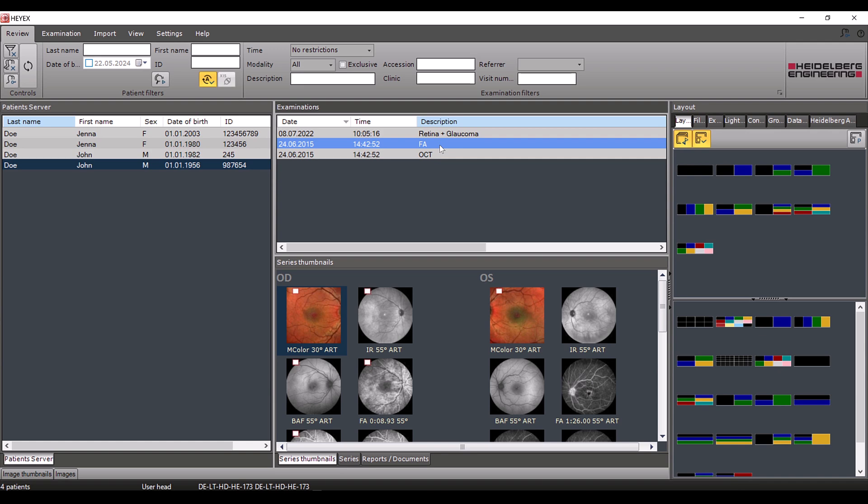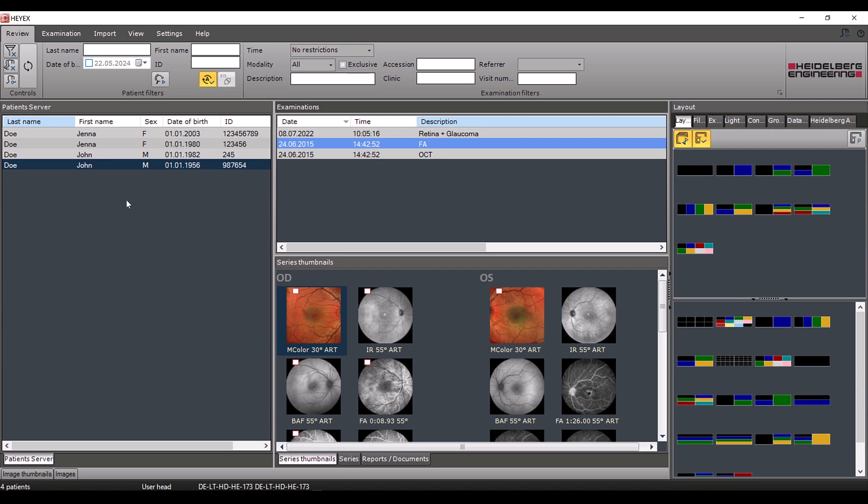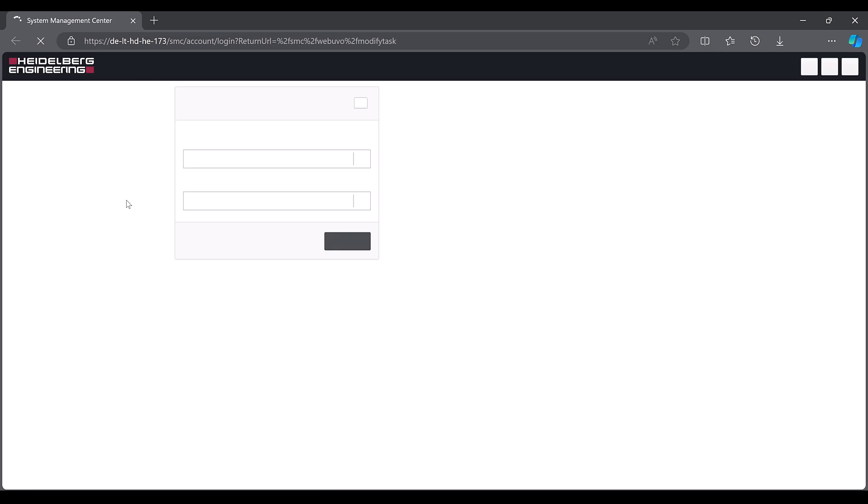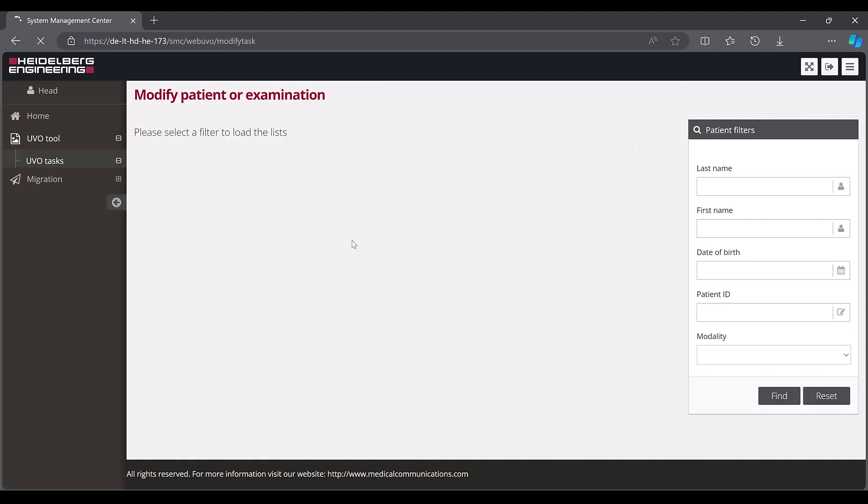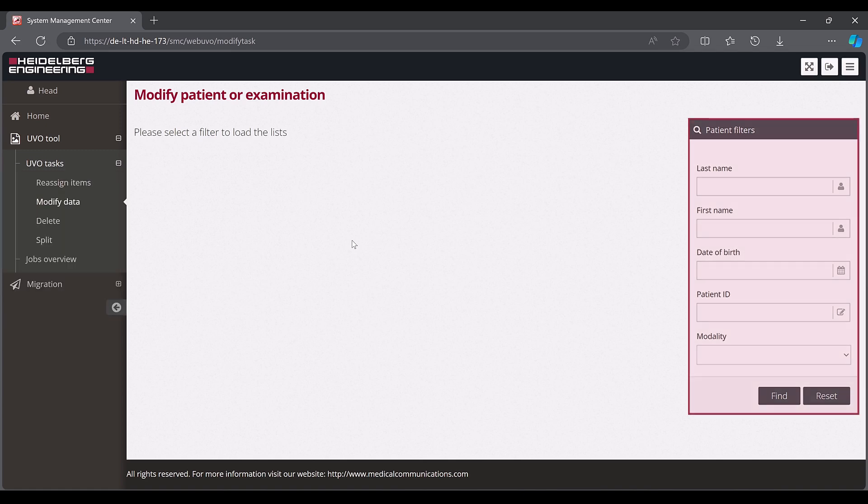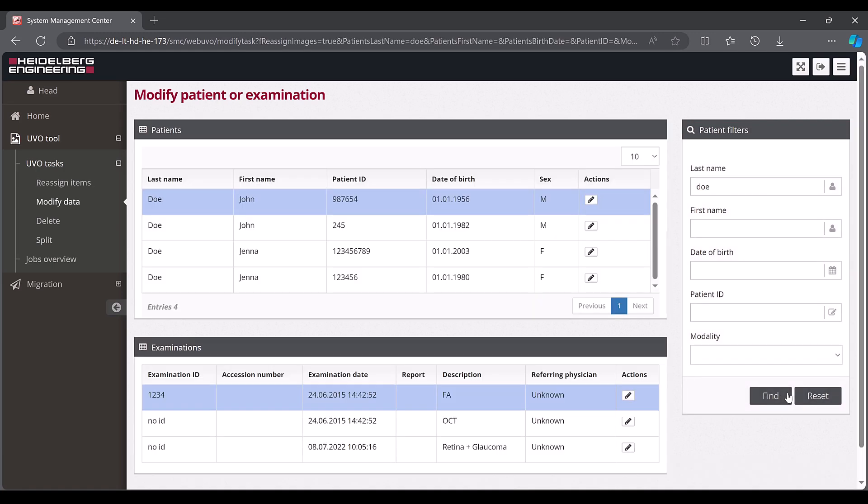Right click the patient list and select start the UVO tool. The system management centre opens in the internet browser. Log in with your HEYEX username and password. First, search for the patient by entering the corresponding name in the patient filters section and clicking find. Then select the split action.